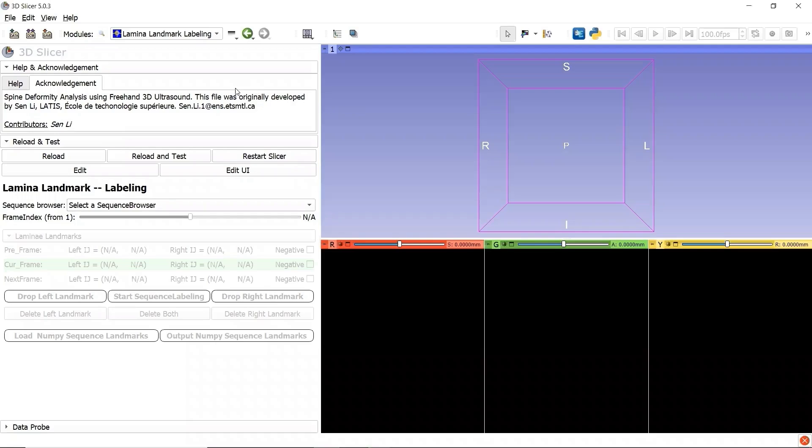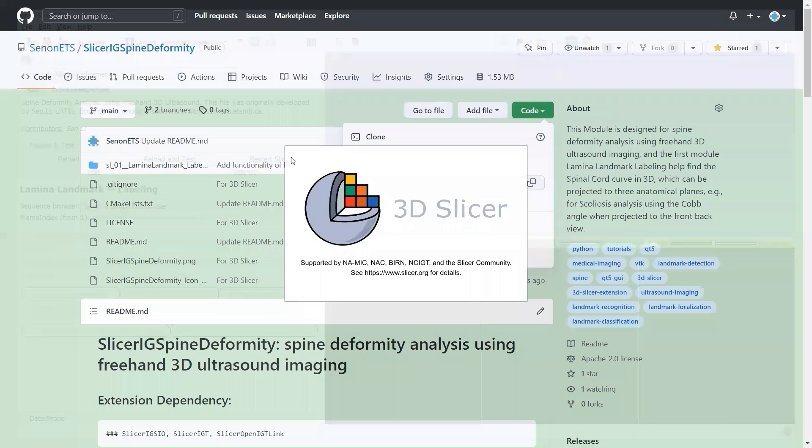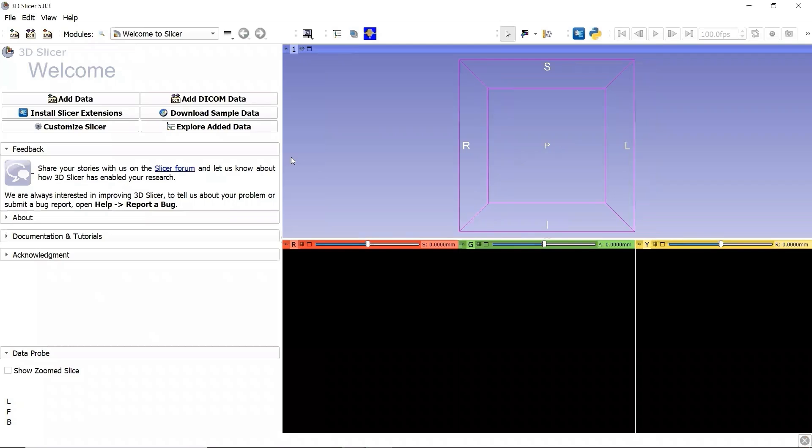Don't forget to restart before playing with this module for Spine Deformity Analysis. Click the button Restart Slicer and wait a few seconds for Slicer to restart. Here we go.